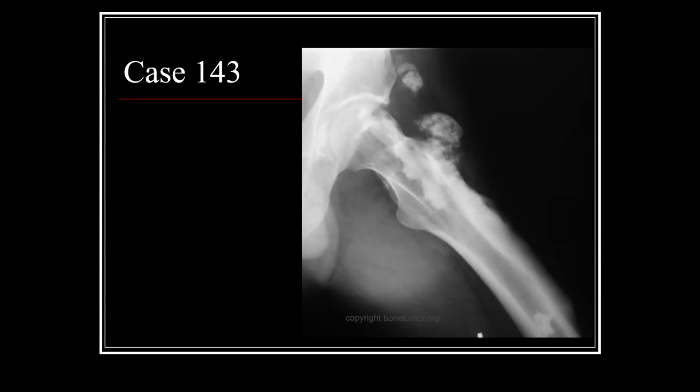And even as many times as we rotate the patient and try to get lateral or angular views, we may not always be able to define that. Additionally, we see there's some abnormality here along the cortex extending. So you've got the possibility that you've got an osteoblastic and cortically destructive or expanding type of lesion here as well. So this is a very complex type of pattern with a lot of areas of expansion.